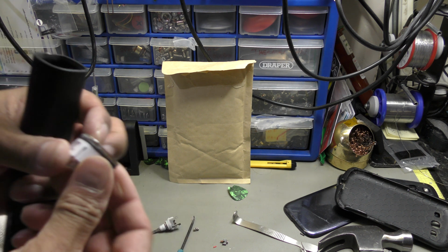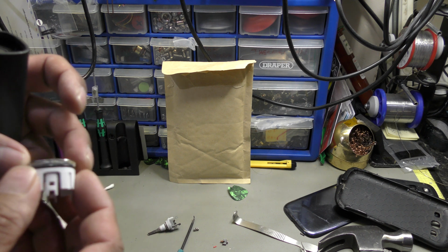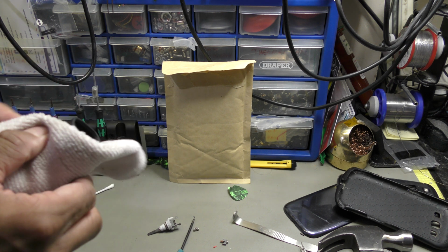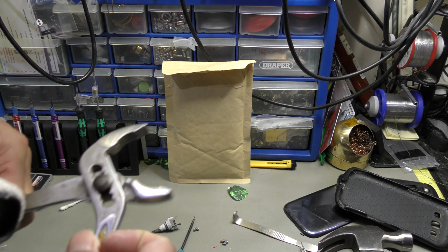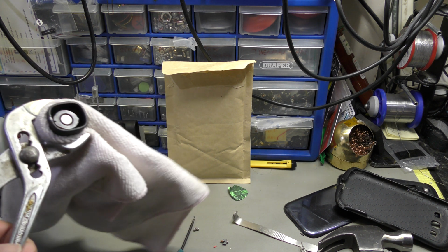Okay, the cap has a bit of a washer, a rubber seal, I should say. All you do is press with a bit of grip. So apply a bit of cloth around so you're not scuffing the housing. Get yourself a little grip and apply a bit of pressure like that.